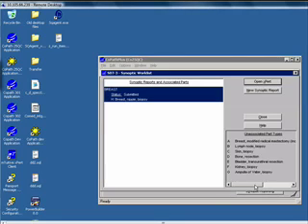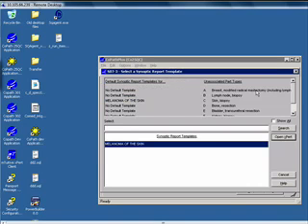We have launched the synoptic work list. At the right side on the bottom, we can see all the part types that do not have synoptic reports completed for them. Here we can choose to work on an existing report or open a new report. Default synoptic templates can be assigned in the CoPath library for each of the synoptic reports. As you can see in the list of part types for this case, the system has not assigned default checklists for the majority of our part types.